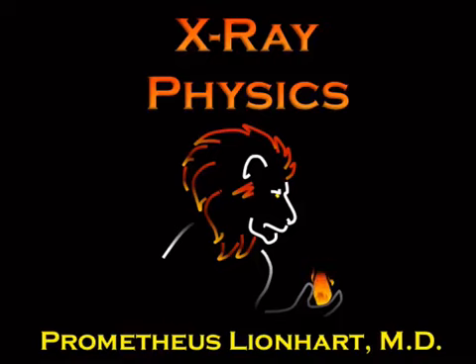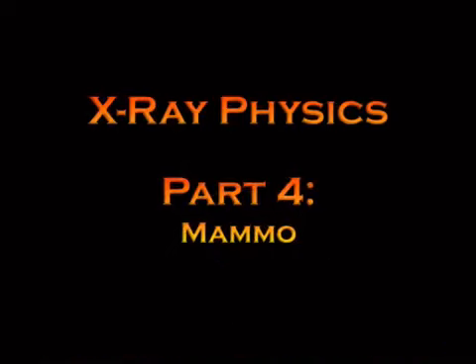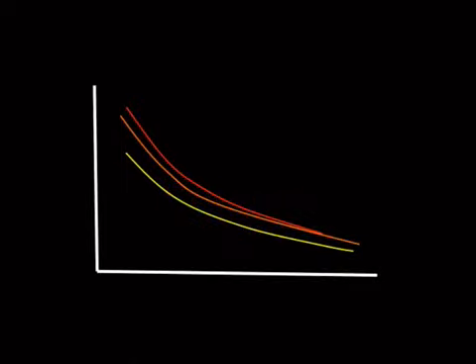Okay, so this is our next physics talk. This is a mammo physics talk. So, why is mammo different than regular X-ray? Why isn't it the same as just taking a chest X-ray or an X-ray of an arm or a leg or whatever? The difference is that breast cancers and breast tissue are very similar in density. Their attenuation is very, very close. So you have to use very low energy to take advantage of that.